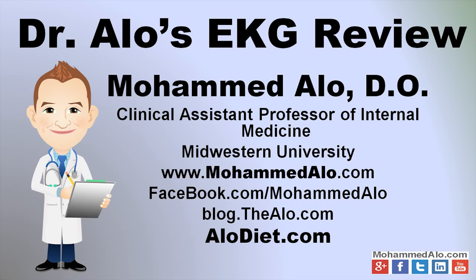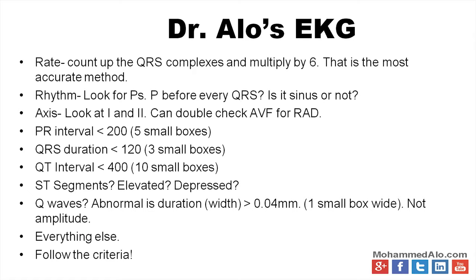So I have some basic rules for EKGs. Of course, in medical school, everyone learns about rate, rhythm, and axis. Well, here's the best way to do this, and then we'll go through all the other segments. Basically, we're going to go through a quick EKG review and then go through a whole bunch of EKGs together. The answers are on the back. The last slide of the lecture is the answers.